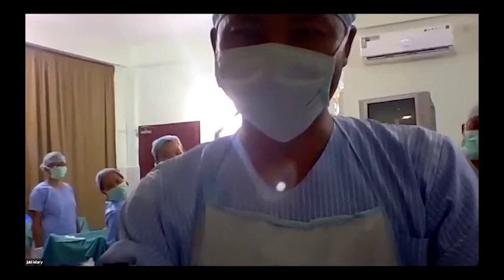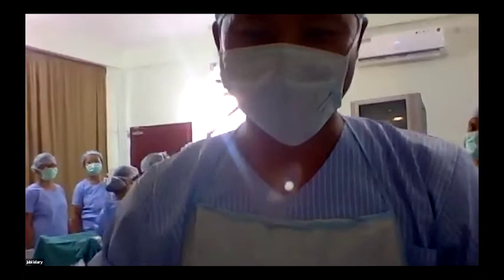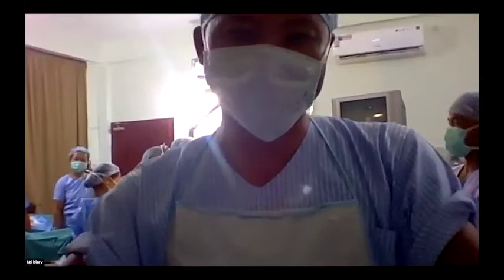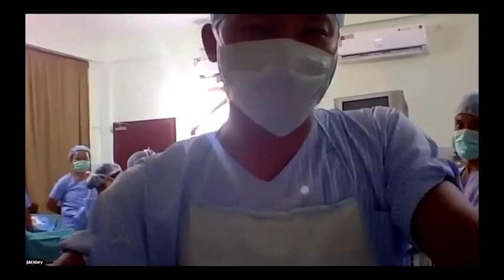And Dr. Biju, what surgery are you doing? We can see your theater now. This is a case of ovarian cyst, multiple loculated, and it is very large, up to umbilicus size. Are you going to do GILLS? I expect so much of adhesions here. I have done an MRI, which has shown a chocolate cyst with the possibility of lots of adhesions. Maybe you can have a look and see. Maybe it is possible, then you can open if you can't.